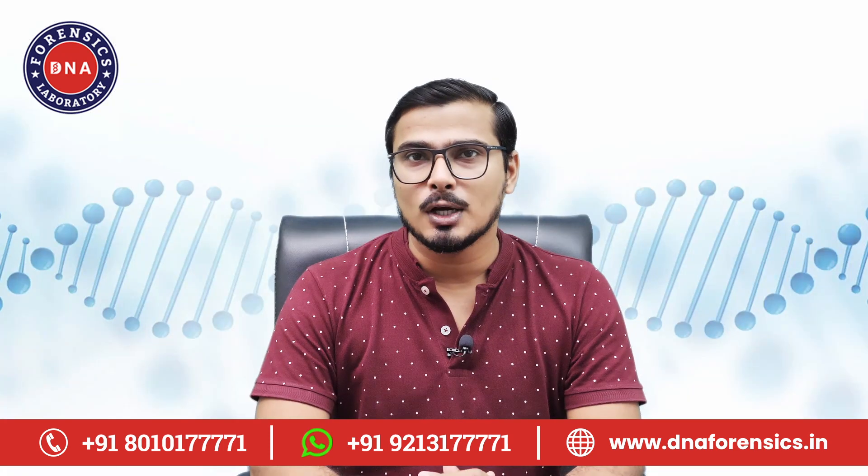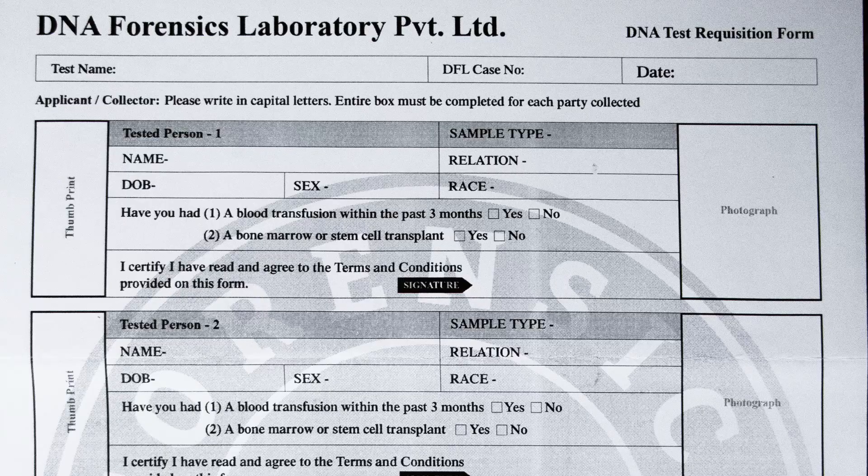Now let's see how to fill out the consent form. On this side of the form, at the top, you have to write the name of the test — like paternity DNA test, siblingship DNA test, etc. If you have a case number, write it in the DFL case number column and write the sample collection date. Then write the details of each tested person: name, date of birth, sex, and relationship with the other tested person.